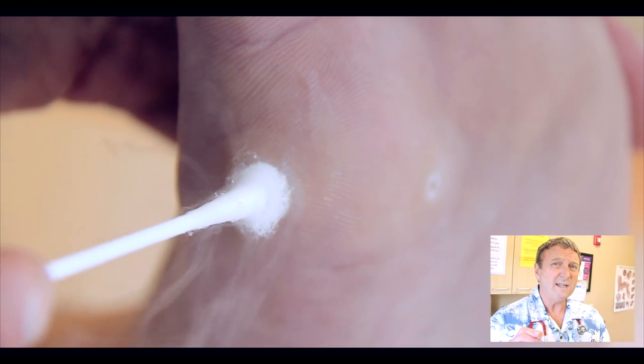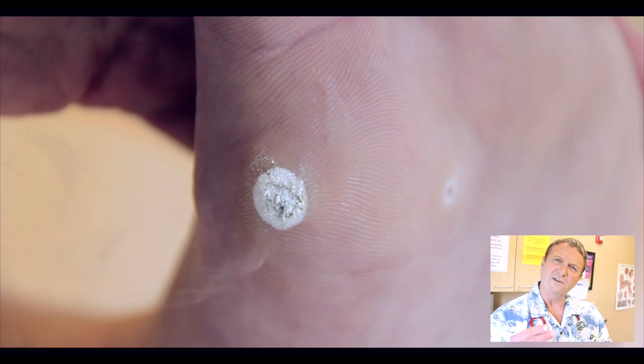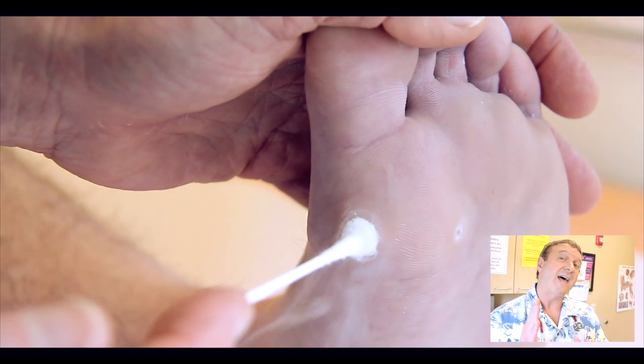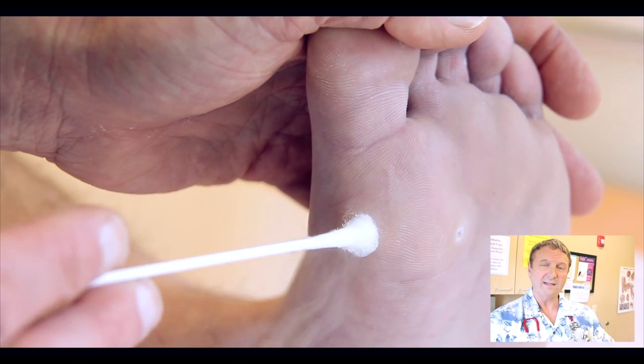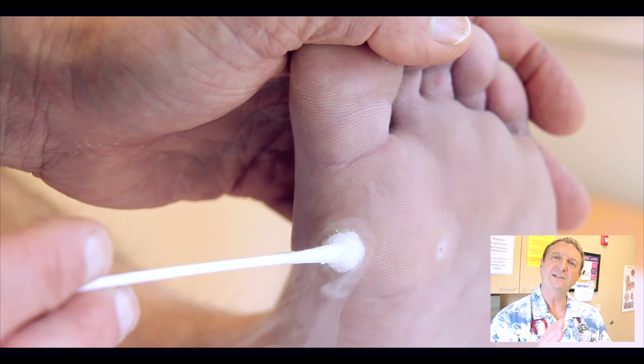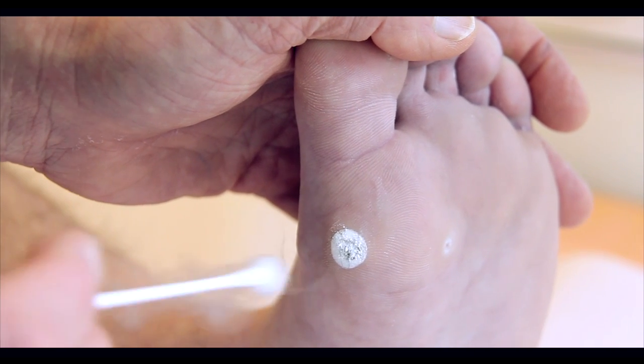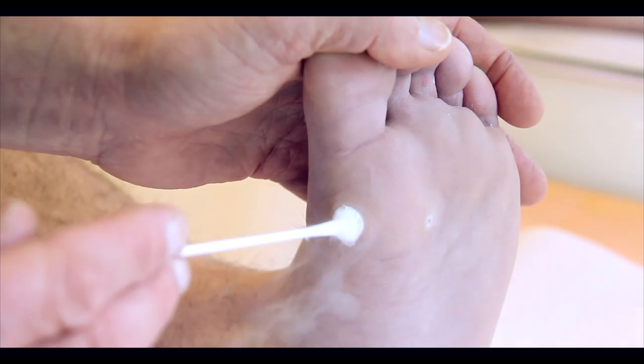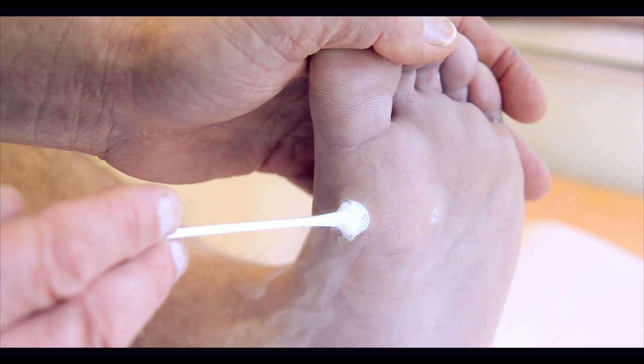Very rarely when you do a deep freeze like this, you can get a blood blister that develops under the wart or right in that area that we froze. If that happens, don't pop it, because at least you have a protection from infection. How are you doing? Okay. I remember when they did this to mine, man, it was... I was not enjoying it. Let's put it that way.